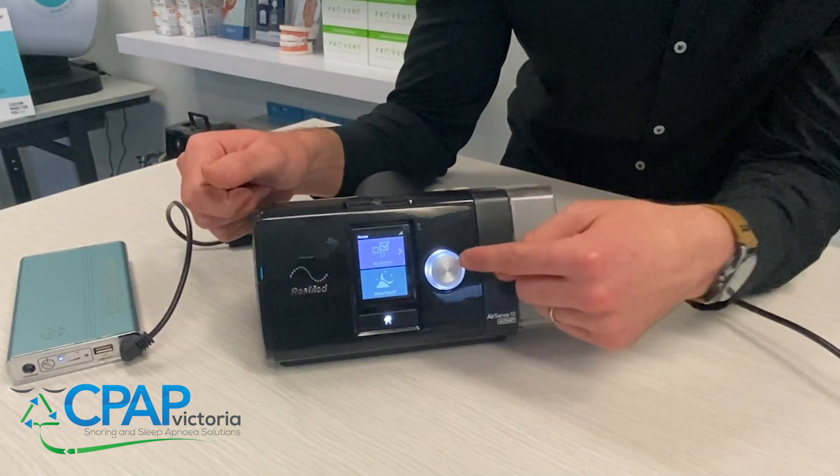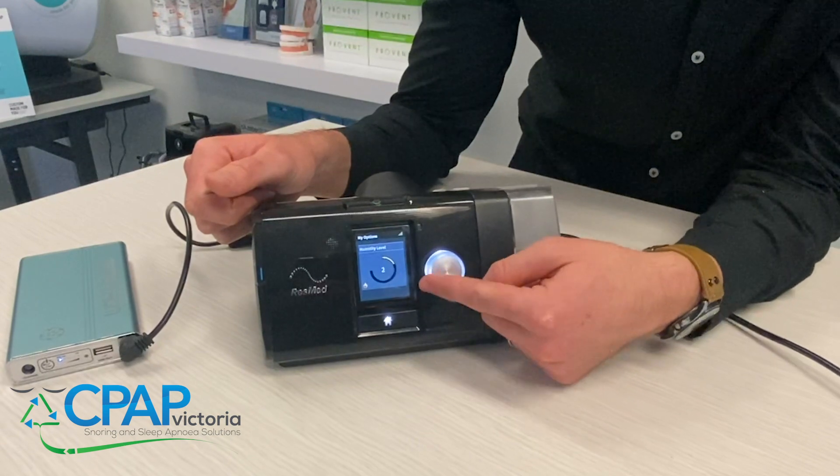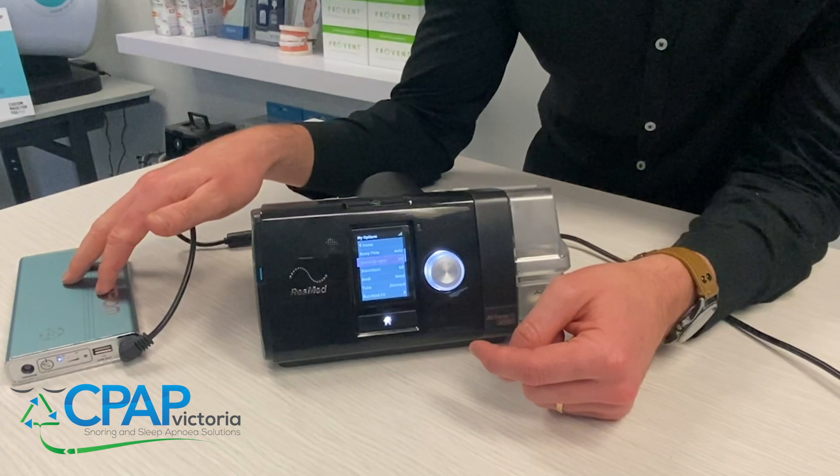If you don't know how to do that, just go into My Options, scroll down to your humidity level, and wind it back until it says off. Then you should be able to get a full night's worth of charge on your battery.